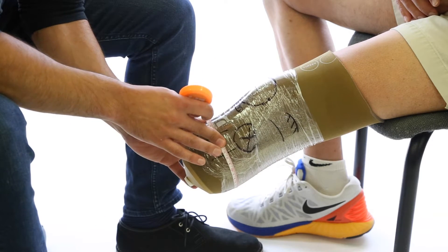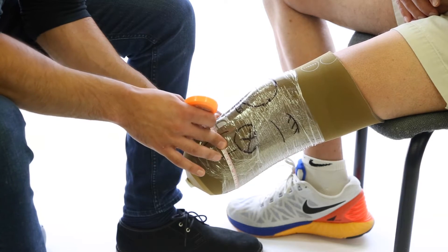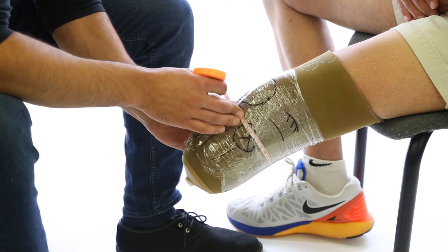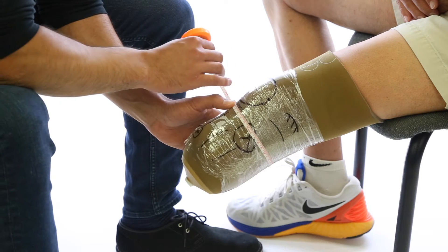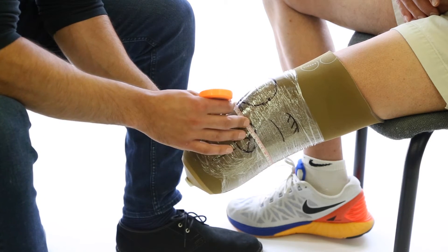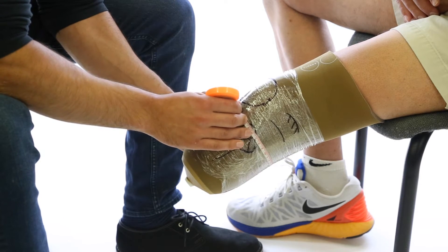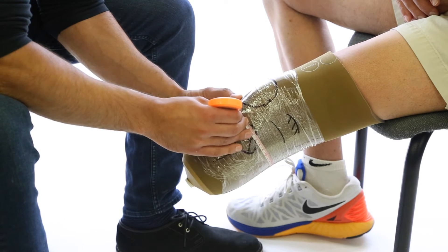Before starting, it would be good to mark where we are taking the measurement so that the marks transfer onto the cast. Make sure the tape measure is tense enough to maintain a consistent level, but do not tension the tape measure more than needed, so as not to compress the soft tissue.